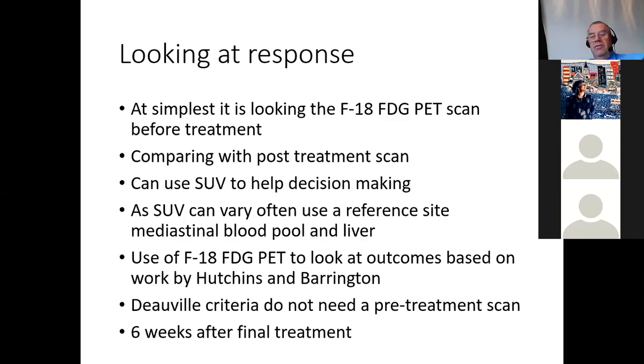So we tend to use a reference site, which is blood pool and liver. And this is based on some work done by a hematologist called Hutchings and a nuclear medicine professor called Sally Barrington at St Thomas's Hospital. And they also developed something called the Deauville criteria. And this does not need a pre-treatment scan. The reason for this is many patients may be diagnosed and treatment initiated in a peripheral hospital without PET-CT, and they come up to the main hospital to have a scan and their treatment further down the line where a PET scan is available.